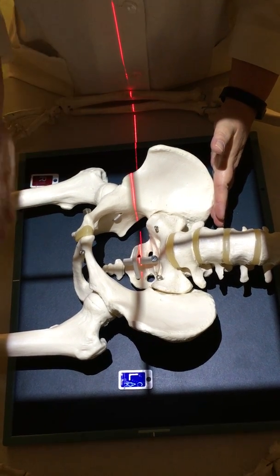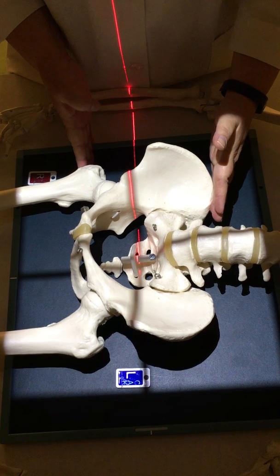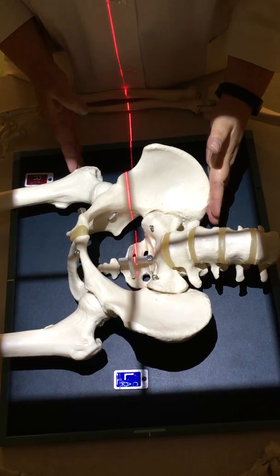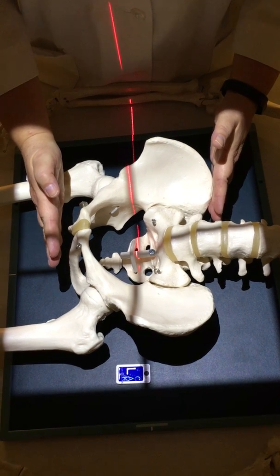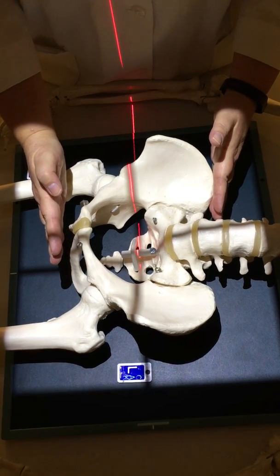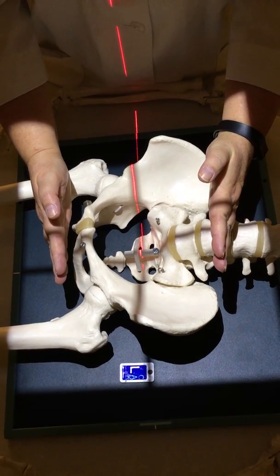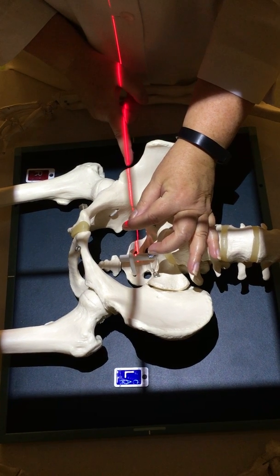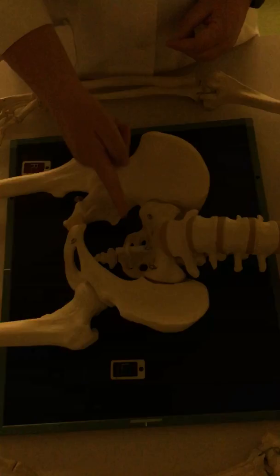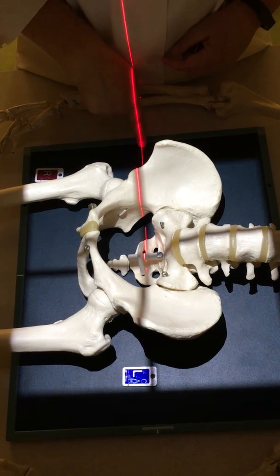You cannot palpate for the ischial tuberosities on a real patient, so if you find the greater trochanter, at the lowest part of the greater trochanter, that's the level of the ischial tuberosities. So here's the top of the pelvis, here's the bottom of the pelvis. Halfway between those two points would be here, which is right where my line is for centering, which is also lined up to the center of the IR.